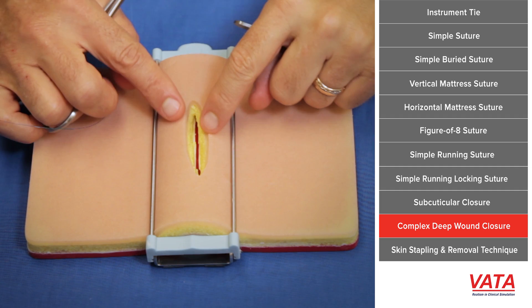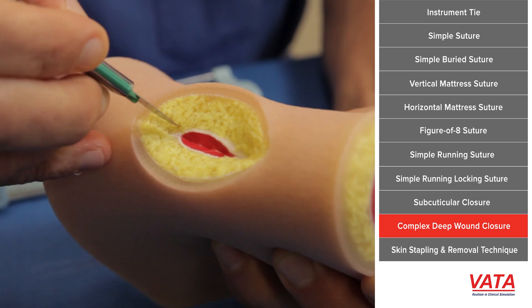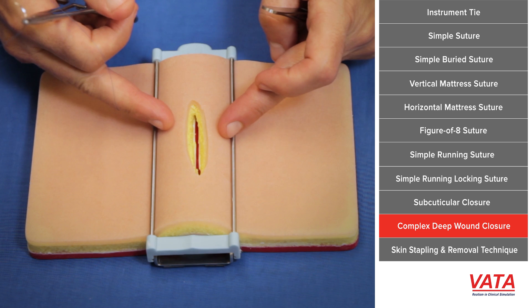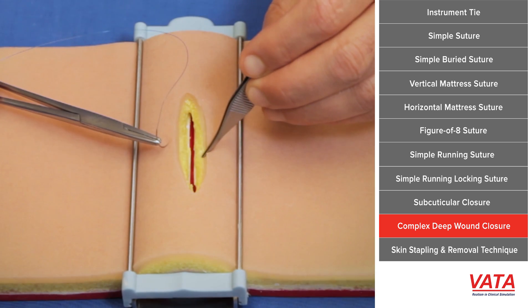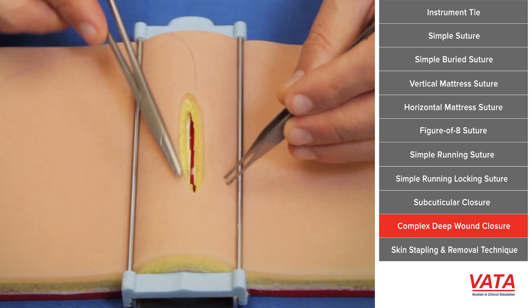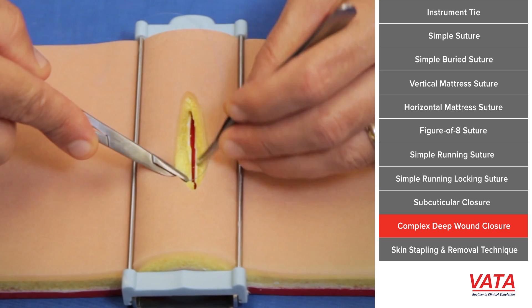One of the advantages of the vada pad is that all the layers of closure are represented. We not only have the skin and dermis, we also have some fat which feels very lifelike, and then deeper we see the white — what I will call fascia or the lining of the muscle — and below is some red which represents muscle. Generally, the strength of closure, especially in deeper wounds, is going to be that deeper white fascia. If we just close the skin here, there would almost be a potential space underneath where fluid could collect, or the skin would have so much tension on it that it would ultimately pull apart. This is especially true over joints where you're bending the arm or bending the knee.